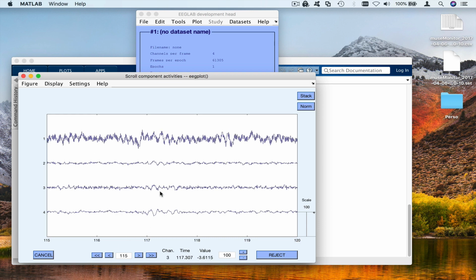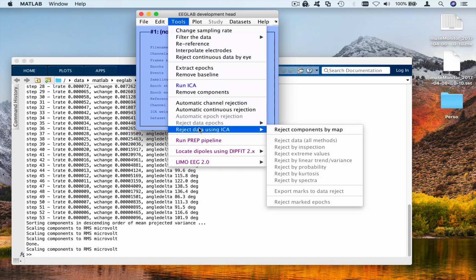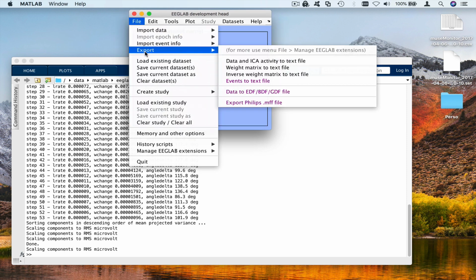We can see here, this is probably some alpha wave here. So we're going to remove component number 1. To do that, first we need to save the components so we can see them later. So weight matrix, we're going to save the inverse weight matrix to a text file.